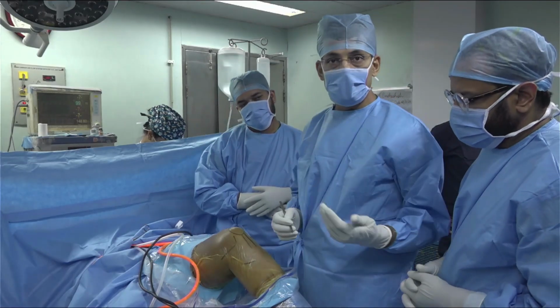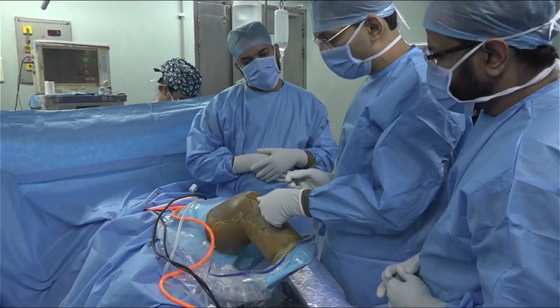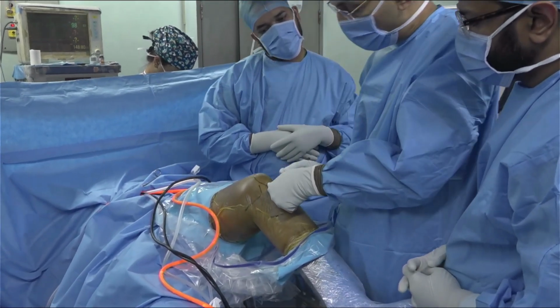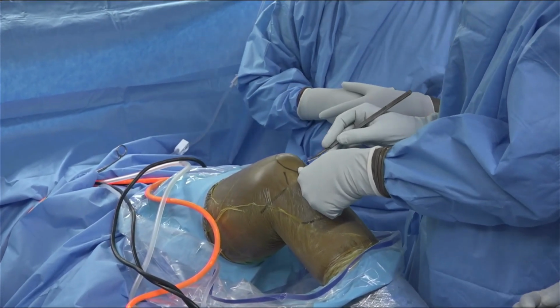So we'll be starting with the diagnostic arthroscopy, and as I told you, I usually press the inferior pole of the patella. By pressing the inferior pole of the patella, you will have two prominences, on the medial and the lateral side, and usually of the surgery we have just performed here.